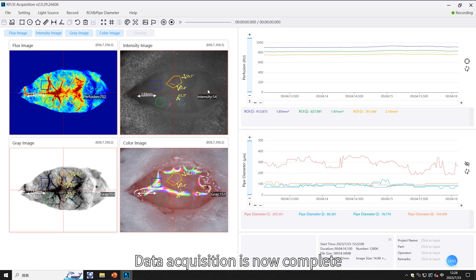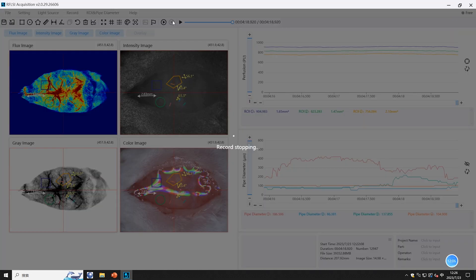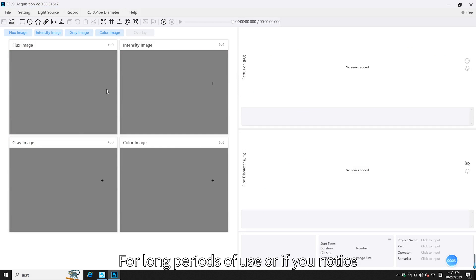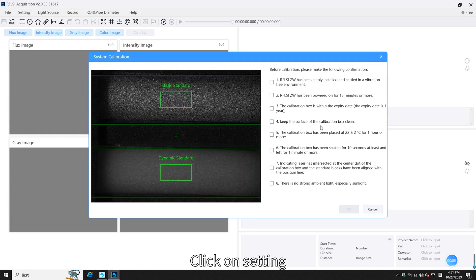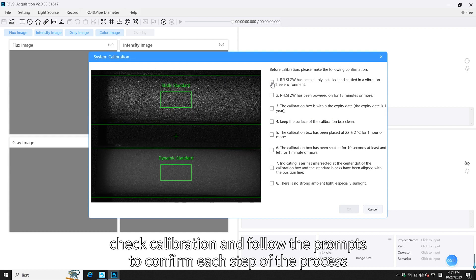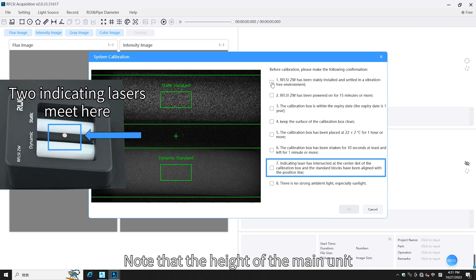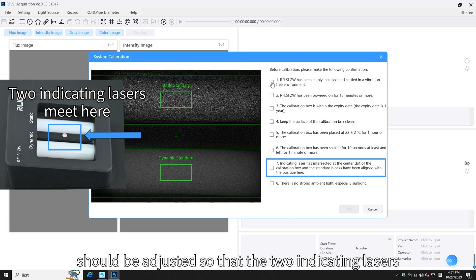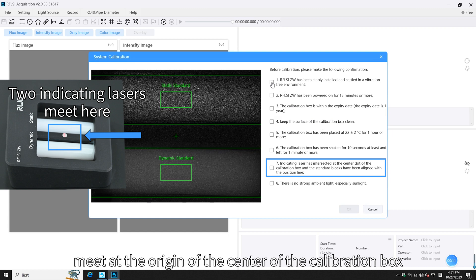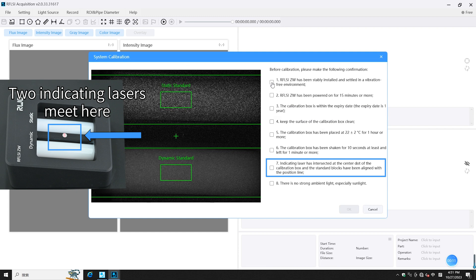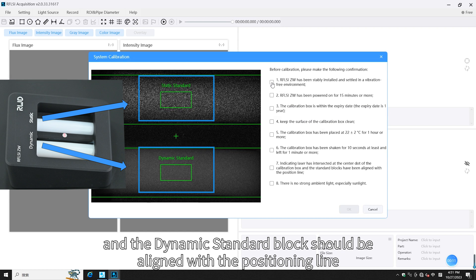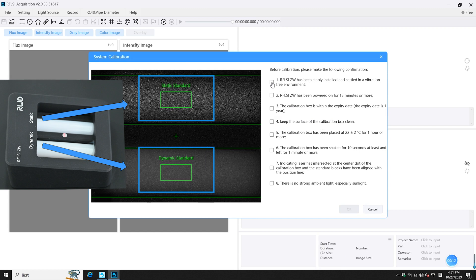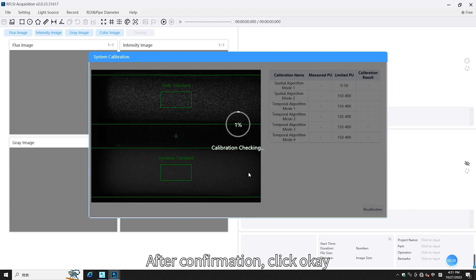Data acquisition is now complete. For long periods of use, or if you notice significant anomalies in the data, the instrument should be calibrated. Click on Setup > Check Calibration and follow the prompts to confirm each step. Note that the height of the main unit should be adjusted so that the two indicating lasers meet at the origin of the center of the calibration box, and the positions of the static standard block and dynamic standard block should be aligned with the positioning line. After confirmation, click OK.